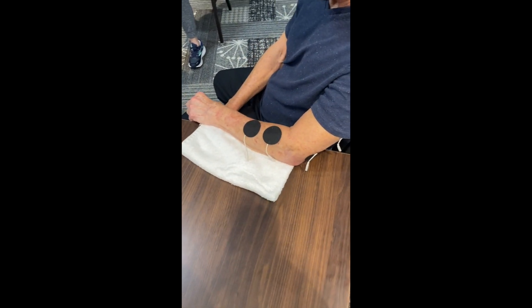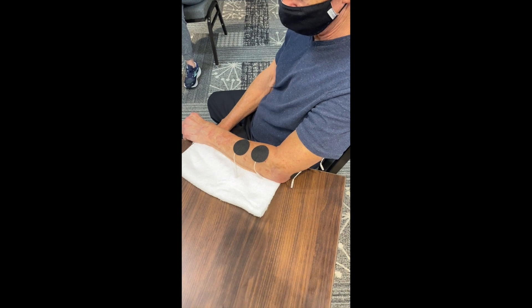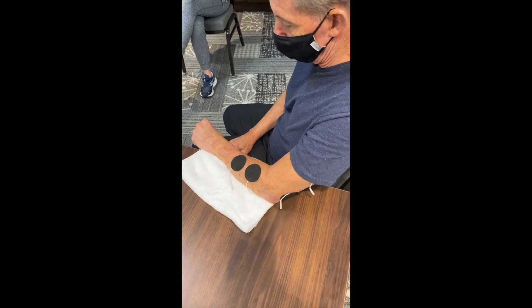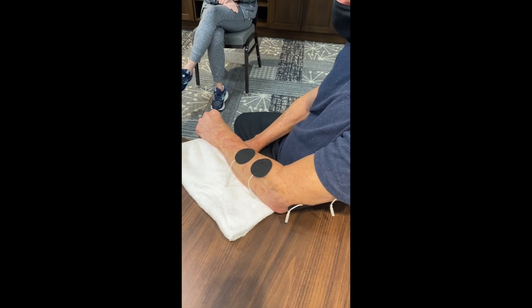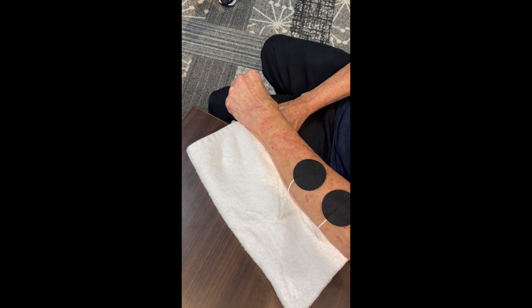We want to see if Daniel can extend his wrist and fingers and his elbow at the same time, and see what his muscles do. So go ahead, Daniel, and try to extend that wrist and fingers and straighten your elbow. We can see that's a struggle there — he has a hard time straightening the elbow, and those fingers are not opening up and behaving.